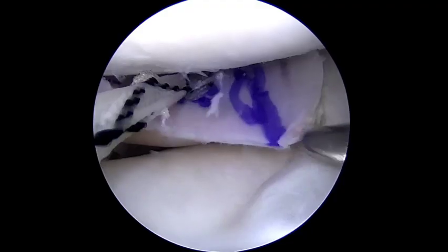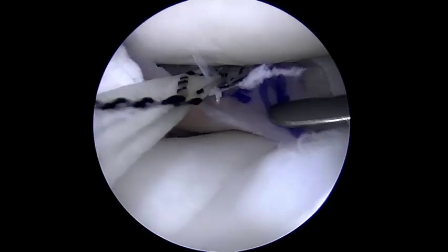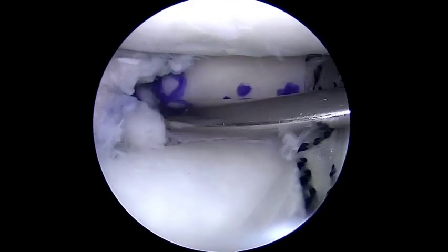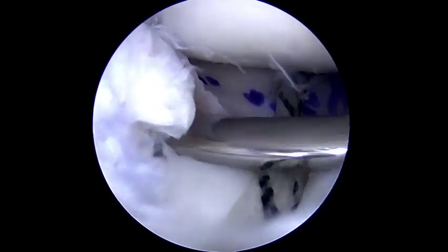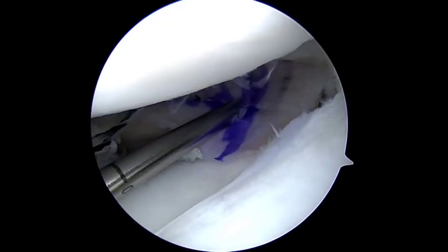The meniscal allograft is then introduced into the joint from the anterior medial portal and positioned under direct arthroscopic visualization at the prior resected footprint of the lateral meniscus. The previously placed fiber stick suture is then used to pass the posterior medial fiber wire suture attached to the meniscal allograft through the previously drilled tunnel at the meniscal root.